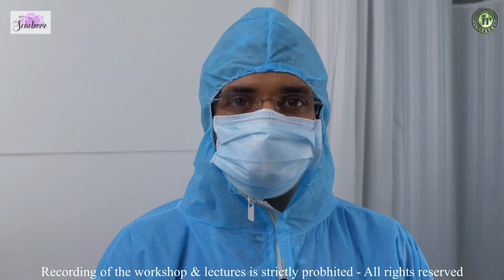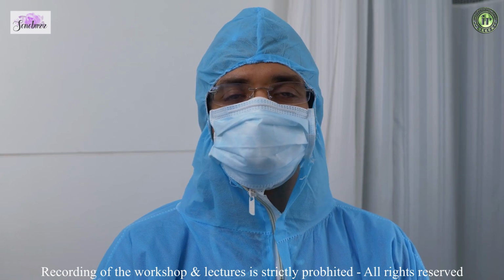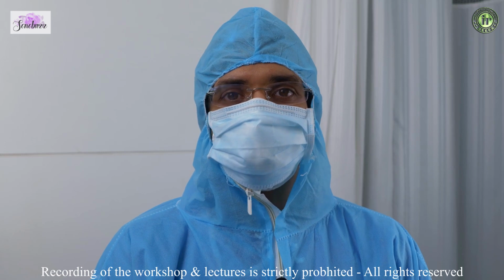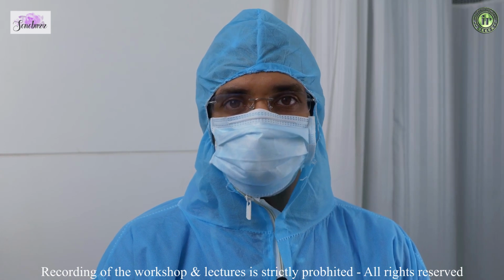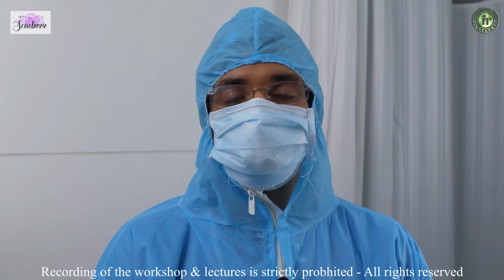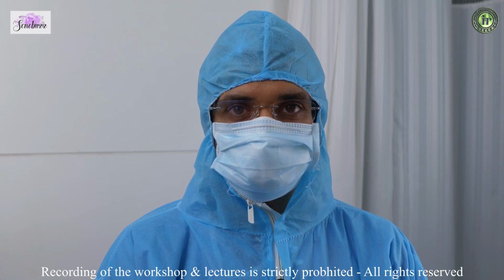Now, one of the first and the most important things when we do elastography is that we don't look at it only as images or only as values. We have to look at the entire clinical picture of the patient. So it's very important that when the patient walks into your clinic, before you do your elastography, you have the entire clinical background in place. So you have to look at the clinical history of the patient.